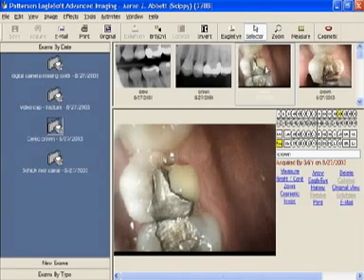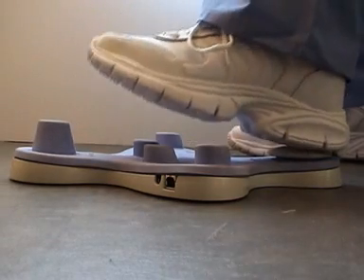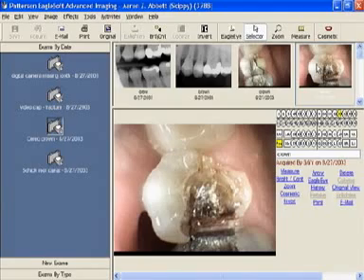It's kind of fun. Depending on your intraoral camera, you can also park your mouse on capture, and when you're in the position you want to, you would just heel click, and it would capture that picture or retake it. It's that simple. Just have fun with it and don't limit yourself.